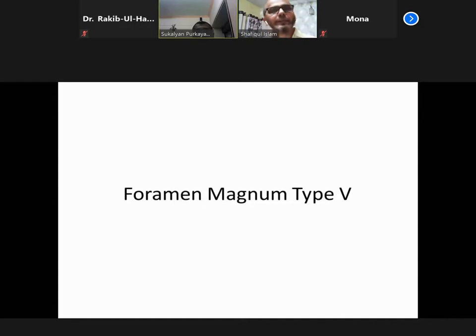I think I have used it in a couple of cases, but I could not get it, because whatever the technician has given, I just put that. Now, balloon, that is Scepter. I used it in a couple of cases of occipital fistula, because with the Scepter you can't take it to the middle meningeal artery. One, it is not advisable to take it into the ascending pharyngeal artery because the ascending pharyngeal is a very tiny vessel and you will invariably rupture the vessel. But I was discussing this in another forum, and they told me that they have taken it.